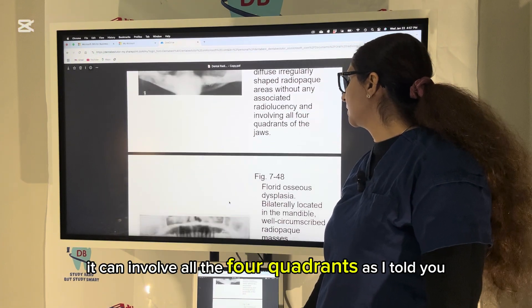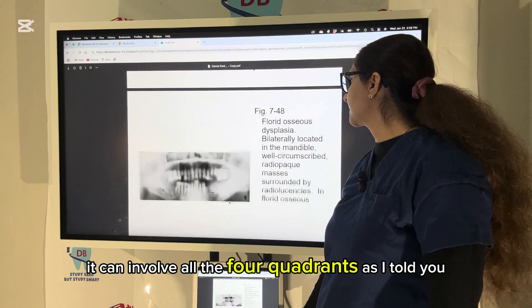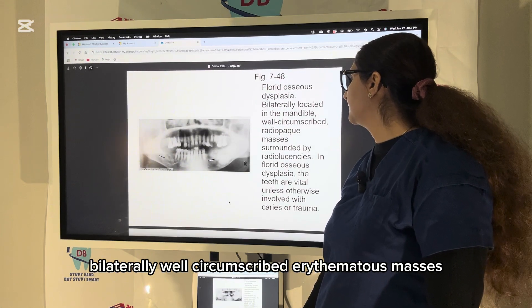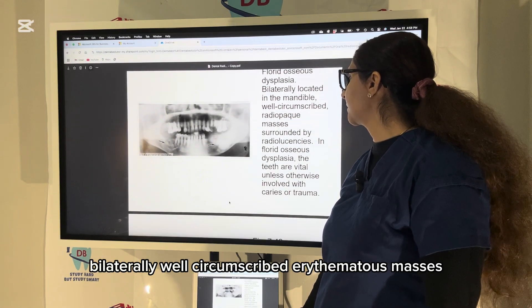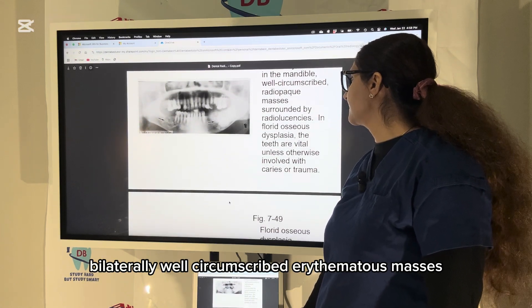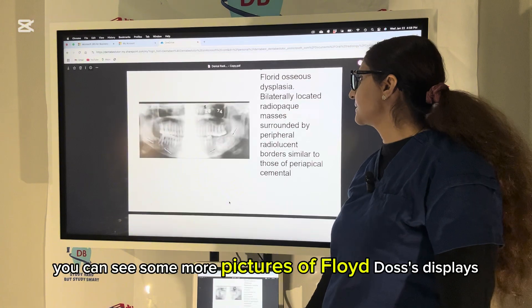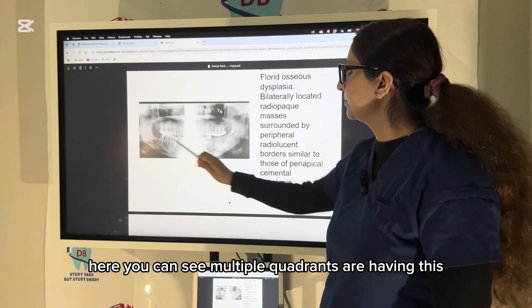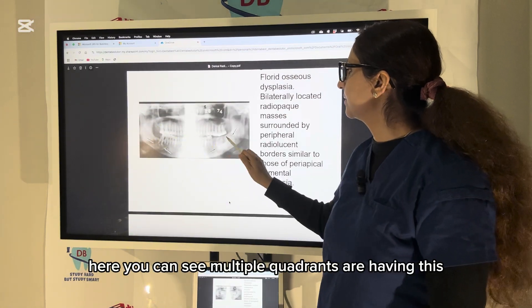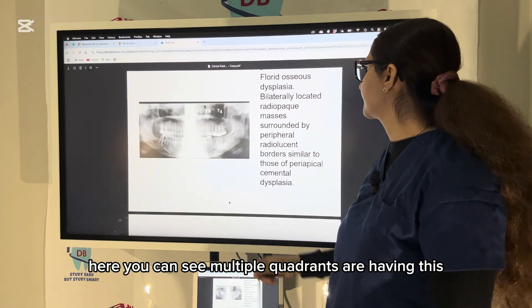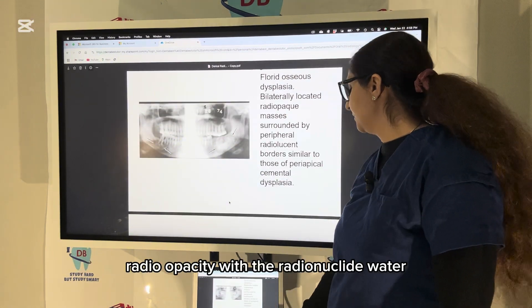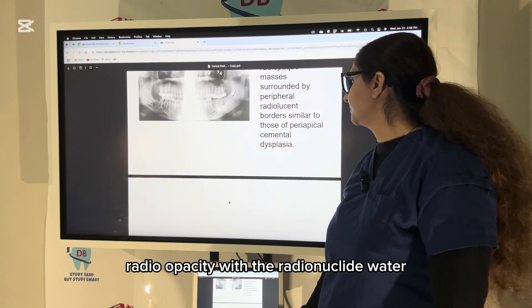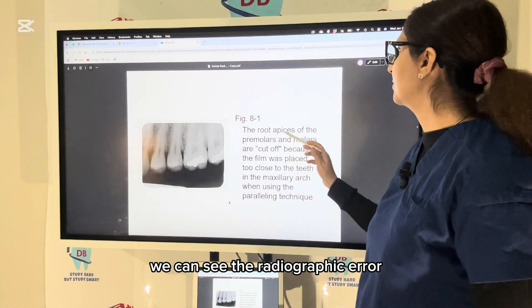Florid osseous dysplasia can involve all four quadrants bilaterally — well-circumscribed radiopaque masses; the teeth are vital. Some more pictures of florid osseous dysplasia: multiple quadrants showing radiopacity with a radiolucent border.